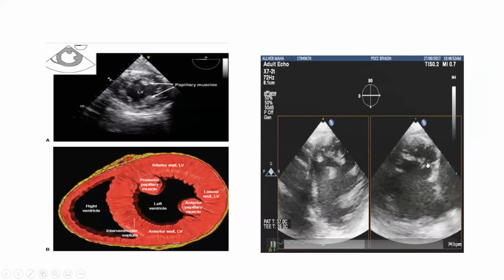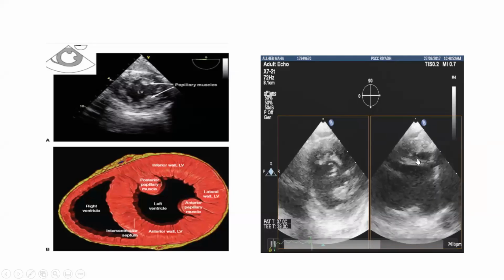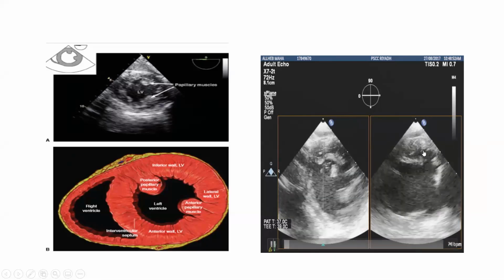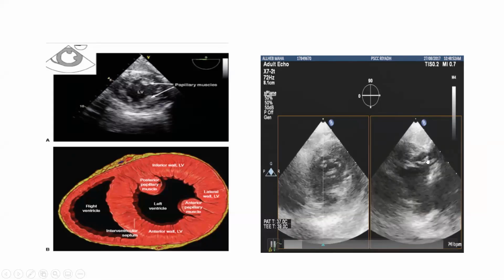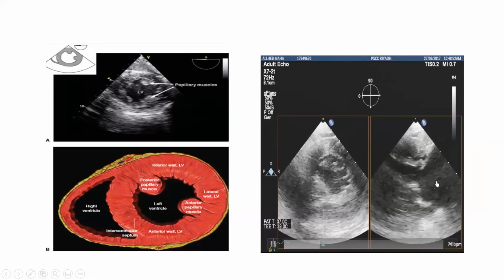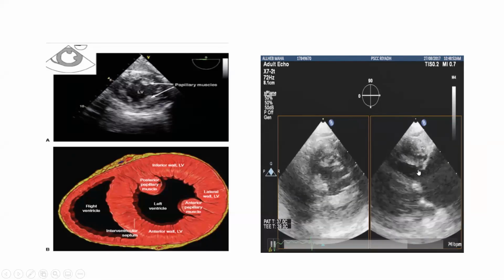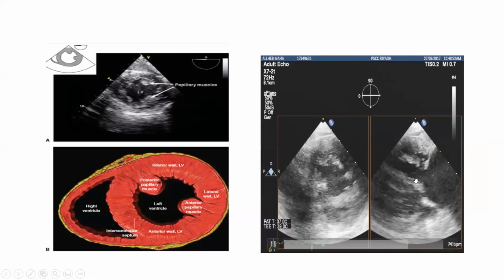When you cut the mitral valve, you can see the chordae. You can even count the chordae. This is the pathological problem here. This patient, post mitral valve ballooning, you can see there is a chordae rupture, and the anterior leaflet is flail here, as you see, with multiple chordae rupture. So this is the cause of the severe MR post mitral valve balloon.